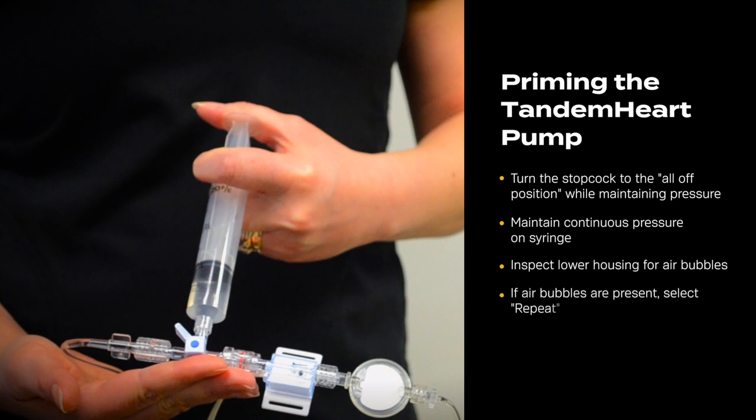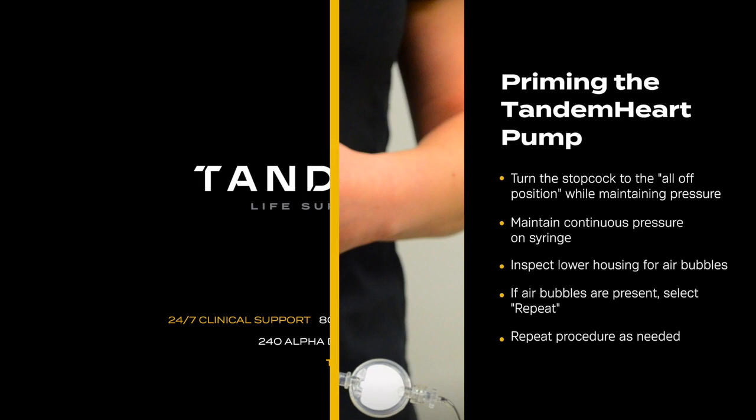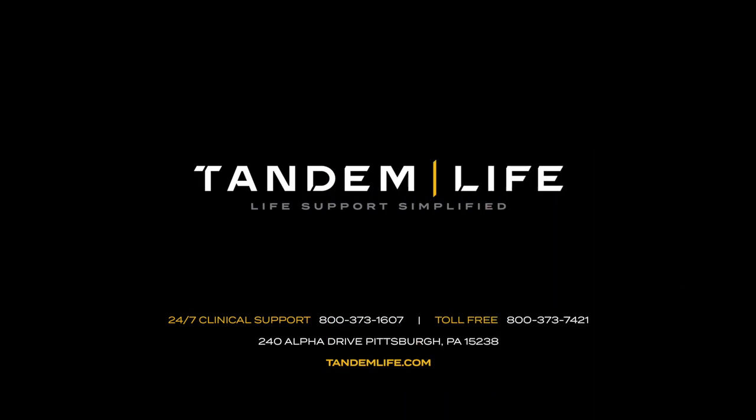If air bubbles are present, select Repeat on the tutorial screen and repeat the pump priming procedure as necessary until all air is removed from the lower housing. Once this is accomplished, the upper housing can be primed. For more information, contact your local TandemLife representative.